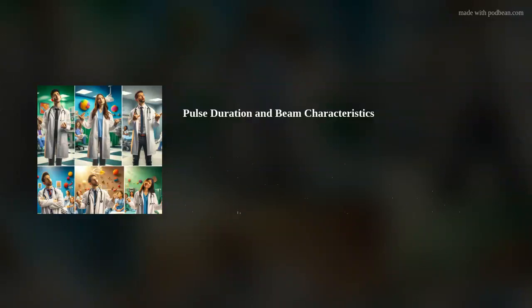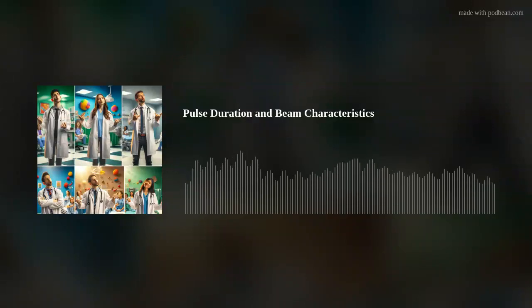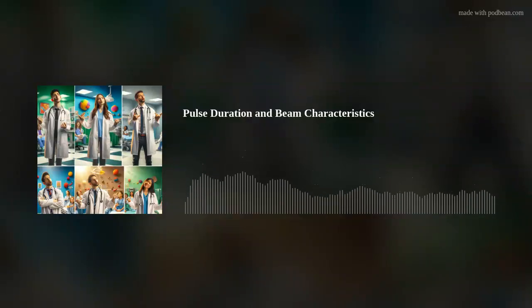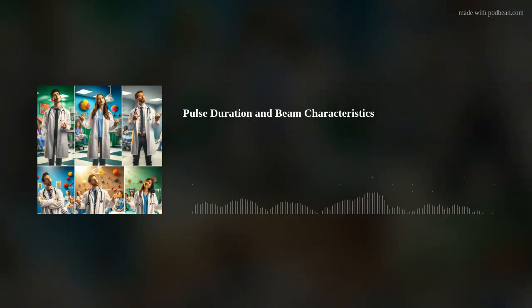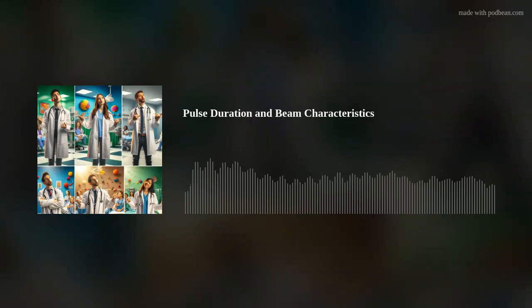Our objective for this talk is to get a better understanding of the ultrasound pulse and its beam characteristics. Now let's consider pulse duration, its definition. Definition and importance are as follows. Pulse duration refers to the time it takes for one ultrasound pulse to occur.